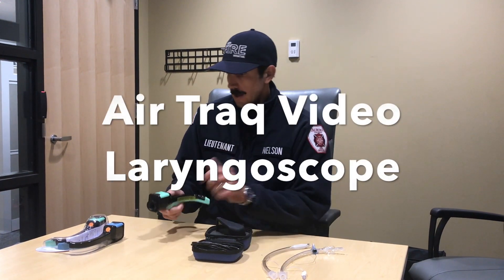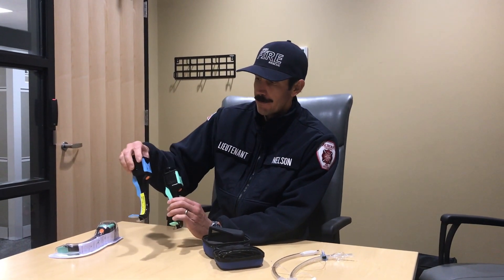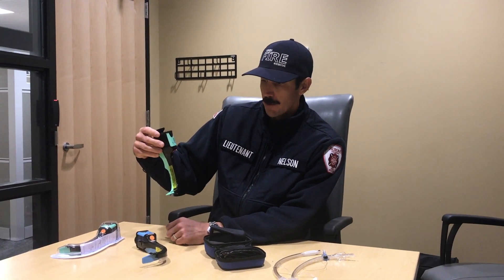Today we're talking about our new AirTrack intubation equipment. It's comprised of two primary components. You have your actual blade — these are disposable blades that come in two sizes. This particular blue blade runs a tube from 7.0 to 8.5, and the green blade covers 6.0 to 7.5.